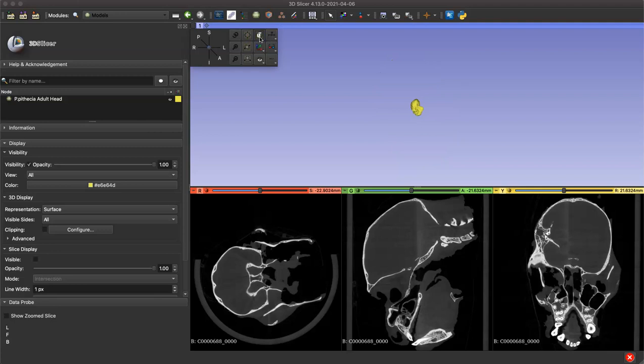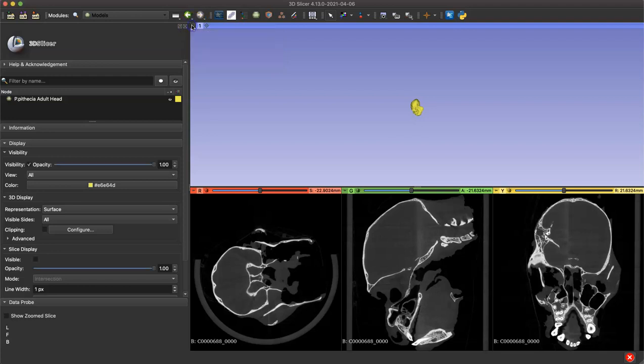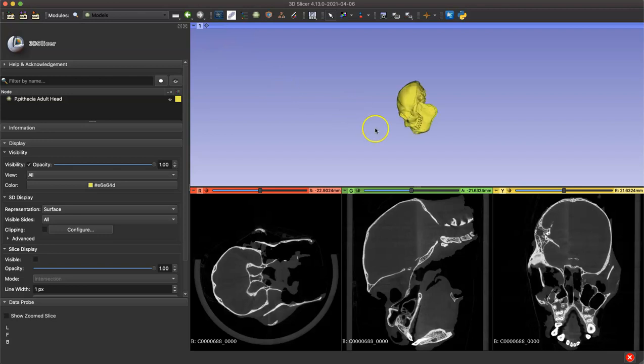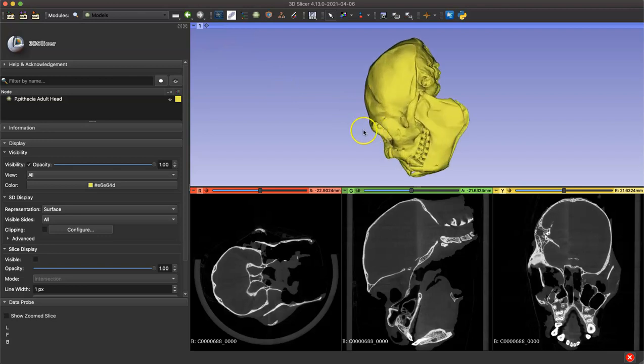Another option is switching from perspective view to orthographic. Again, this is just based on your preference. Then we can click the pushpin again, click the target symbol to center your model in that 3D space, and then we'll zoom in.